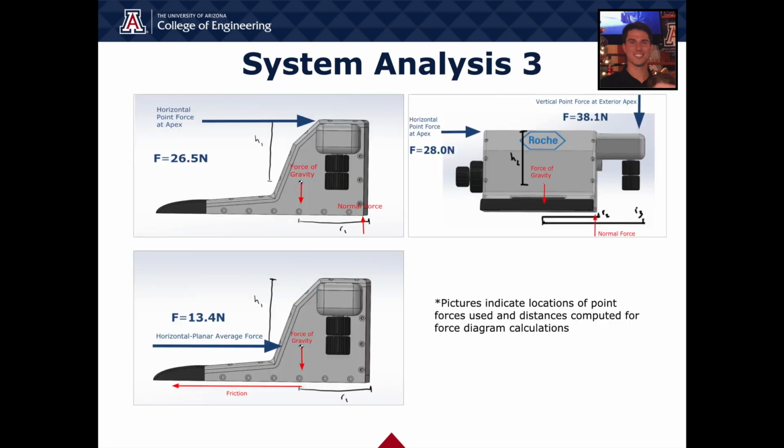settings. Here, our functional goal was to have a design that is both portable and stable. To define stability, we claimed that our device shall withstand tipping or slipping forces of under 10 newtons. To verify our design, we used SOLIDWORKS' center of mass function and MATLAB computations to generate the free body diagram shown here. All the model predictions exceeded the requirement of withstanding 10 newtons.